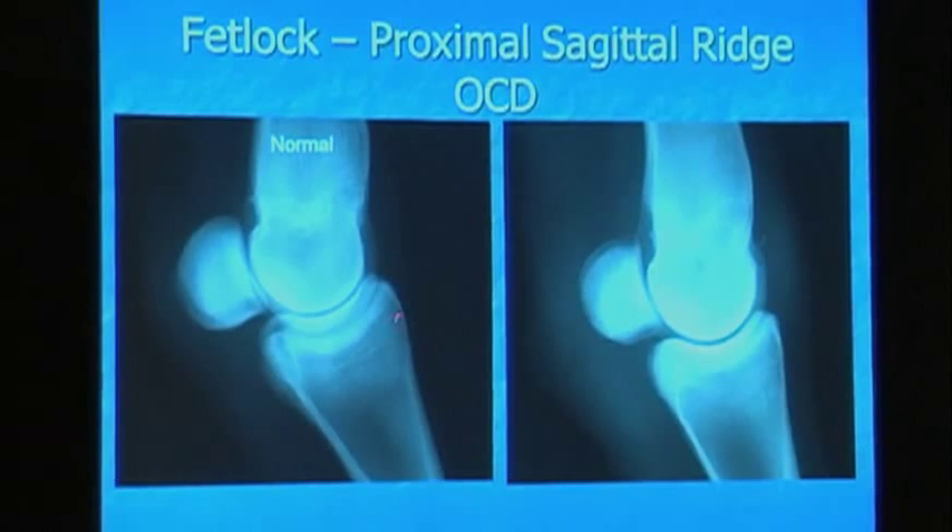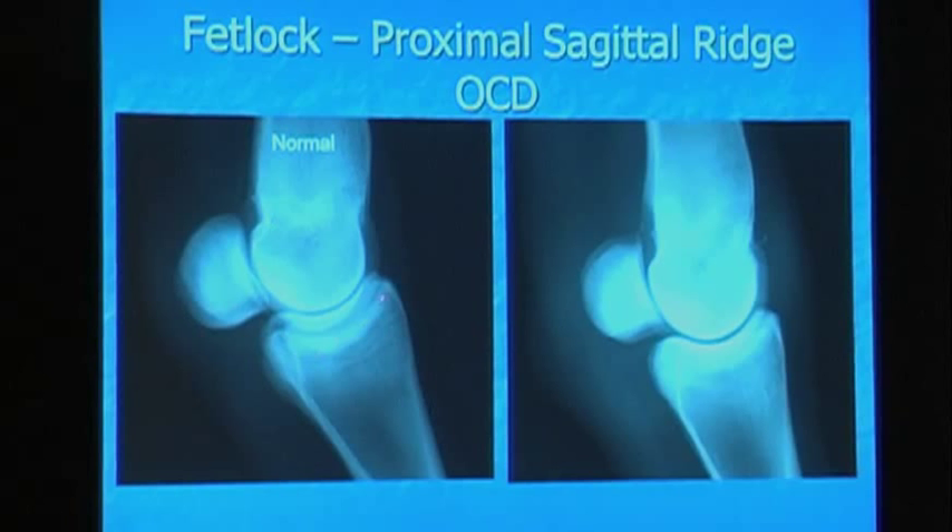Next, we have a proximal sagittal ridge OCD of the fetlock. The sagittal ridge is right around here. You see that thinner area of bone that's a little lighter shade? Over here, same thing, and then you have a fragment at the top. This is a good time to go over what truly is an OCD. We hear about OCDs that heal — were they a true OCD or were they really just osteochondrosis?